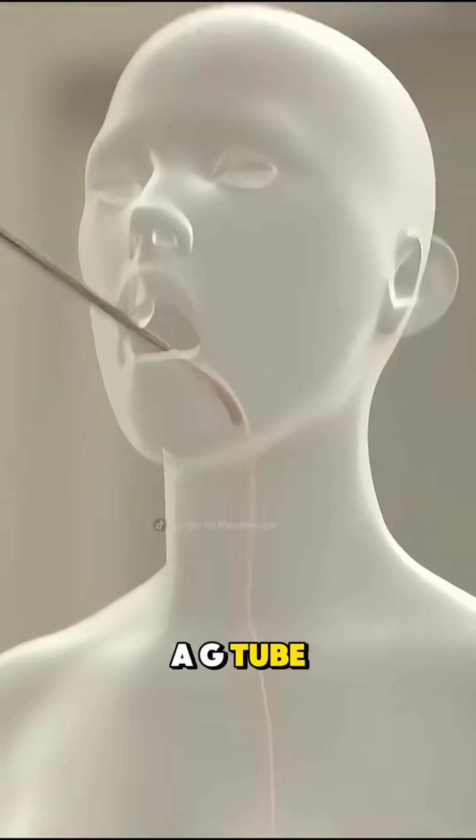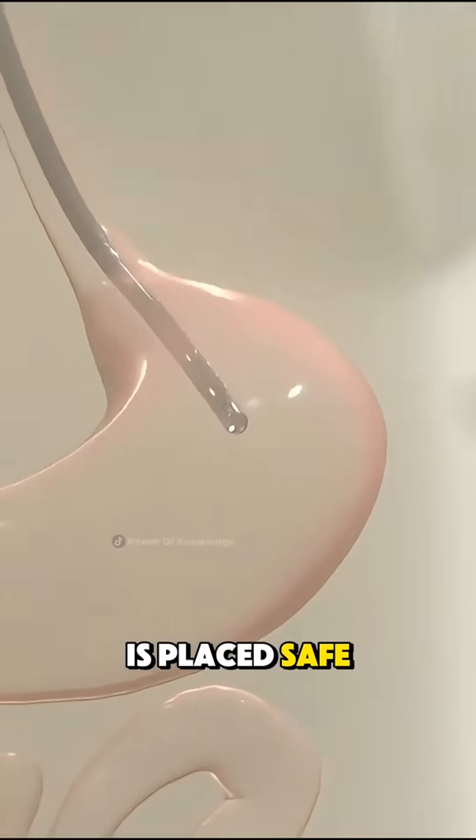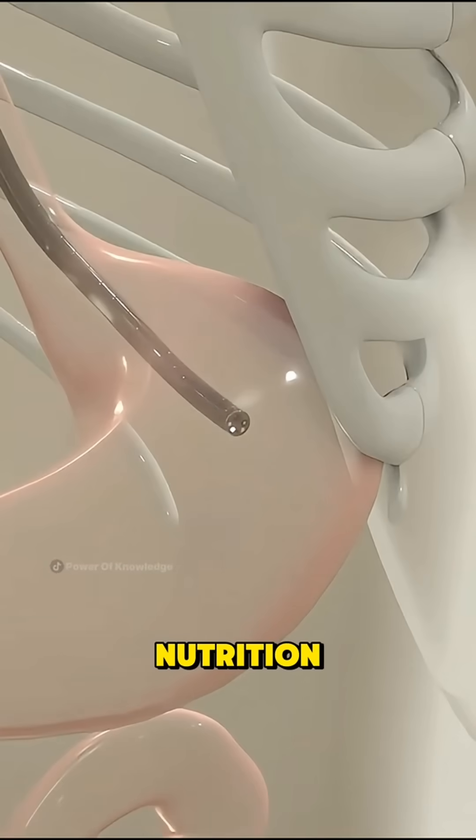And that's how a G-tube is placed — safe, simple, and life-supporting for those who need help with nutrition.